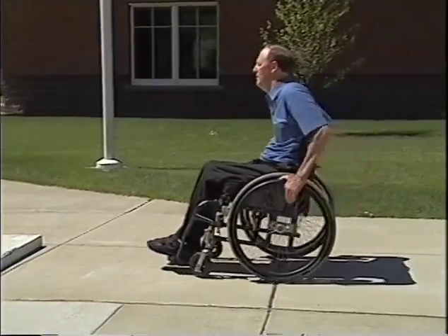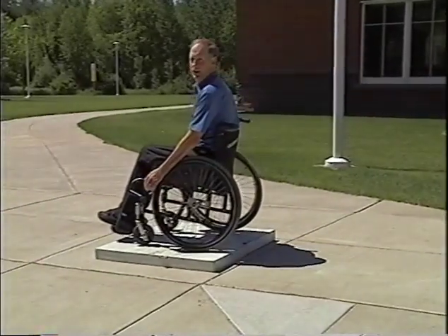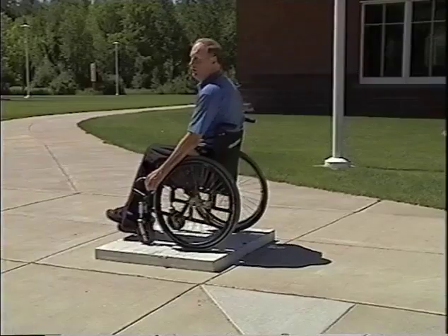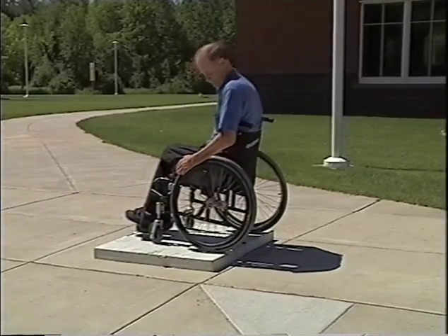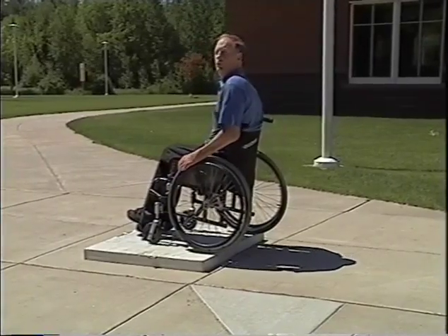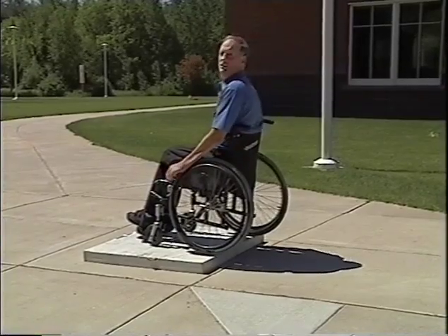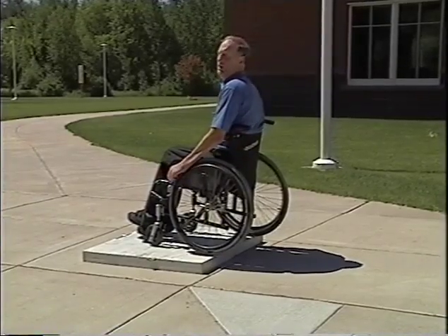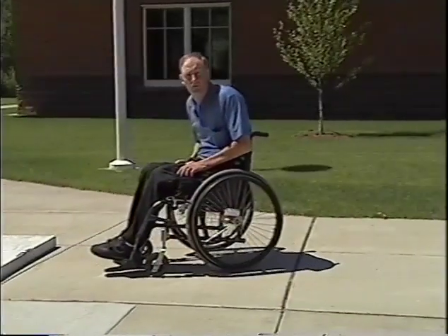Most of it's just timing, and you're on top of the curb. The first method of getting off curbs that I teach is going down backwards. You basically pull up parallel to the back end, and both wheels are going to fall off at the same time. The only mortal sin is stopping. Do not stop. Just fall backwards and let the chair roll backwards.